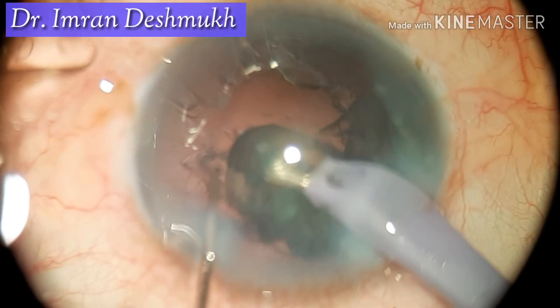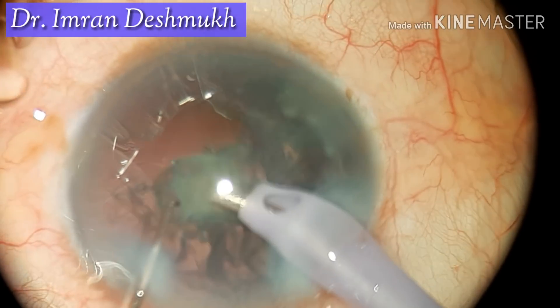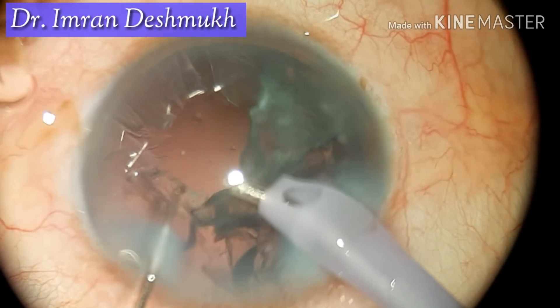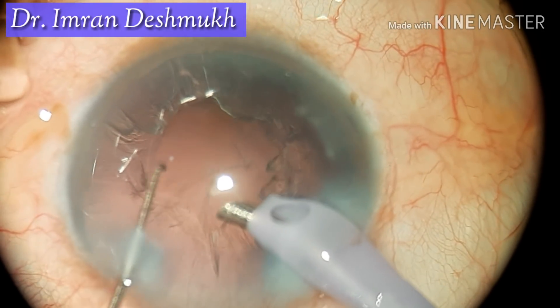So this was one technique for handling the soft nucleus. The other technique is prolapsing the entire nucleus into the anterior chamber and emulsifying it there — I find that one a bit easier. I hope this video was helpful. Thank you very much.